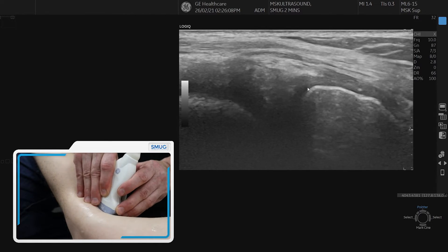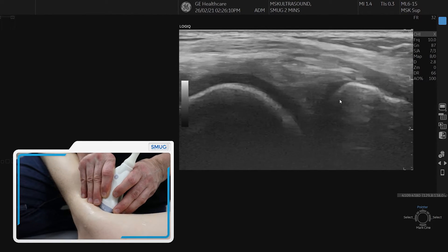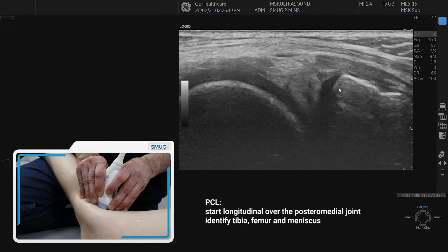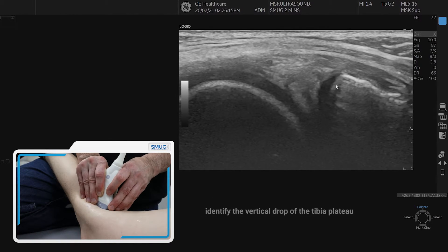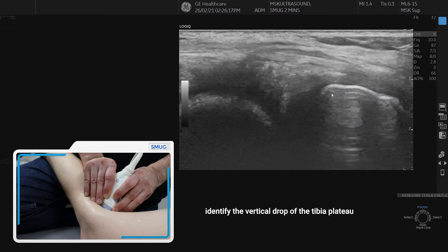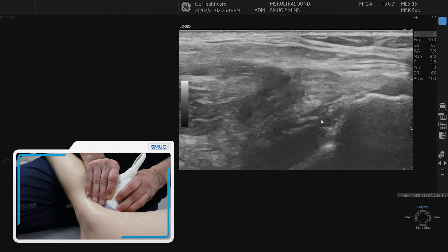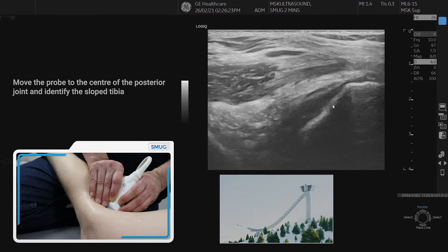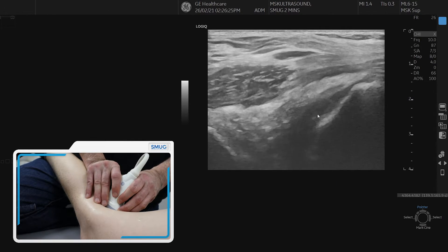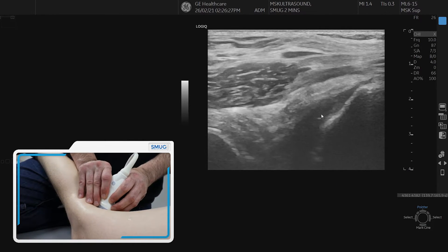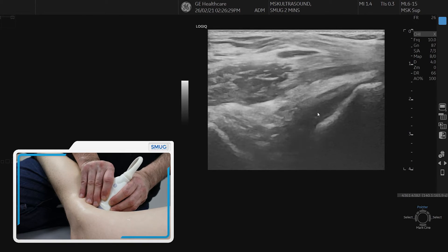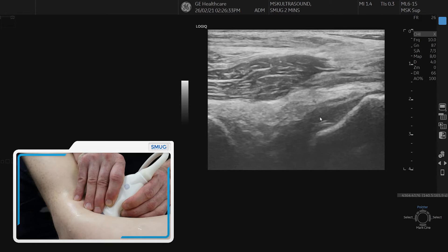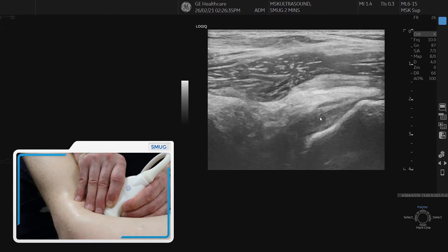Now we go to the central part of the posterior knee to assess the PCL. The first thing is to identify the tibia — the plateau is a vertical drop in this picture. As we go to the center part of the knee, it starts to become like a ski slope, and the only structure on top of that is the PCL, which is usually a dark hypoechoic structure.